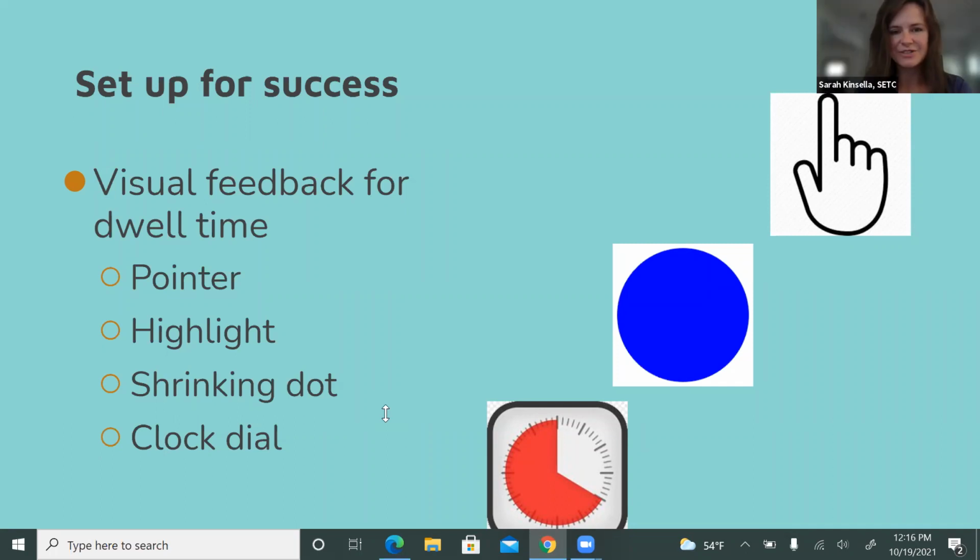Right, that's so true, Brenda. There's another question. Is there eye gaze for an iPad? Yes, and you know what, I took a video of a kid doing it just last week, and I didn't add it to this webinar. With the Skyle, Brenda? Is that what you're talking about? Yes.